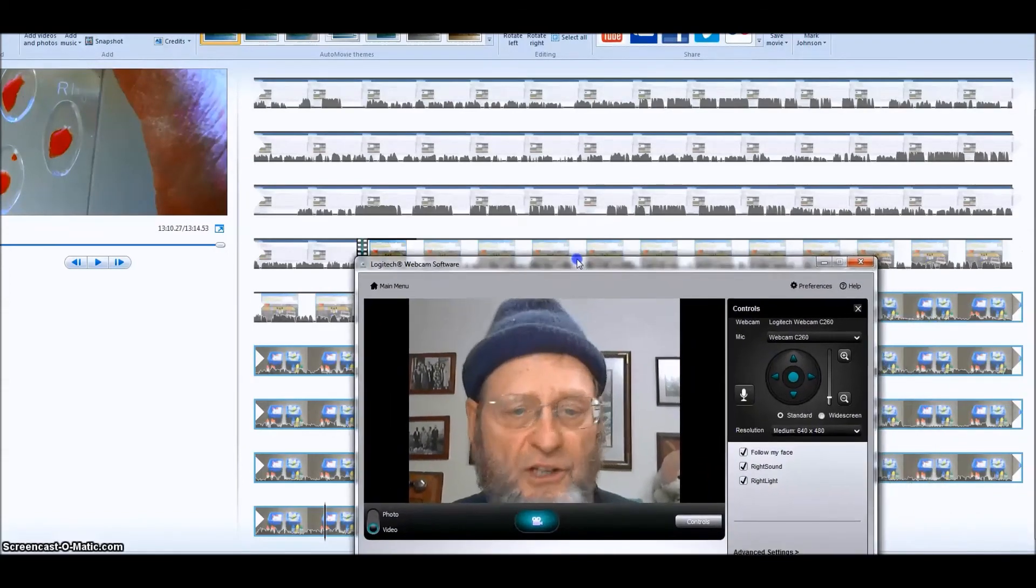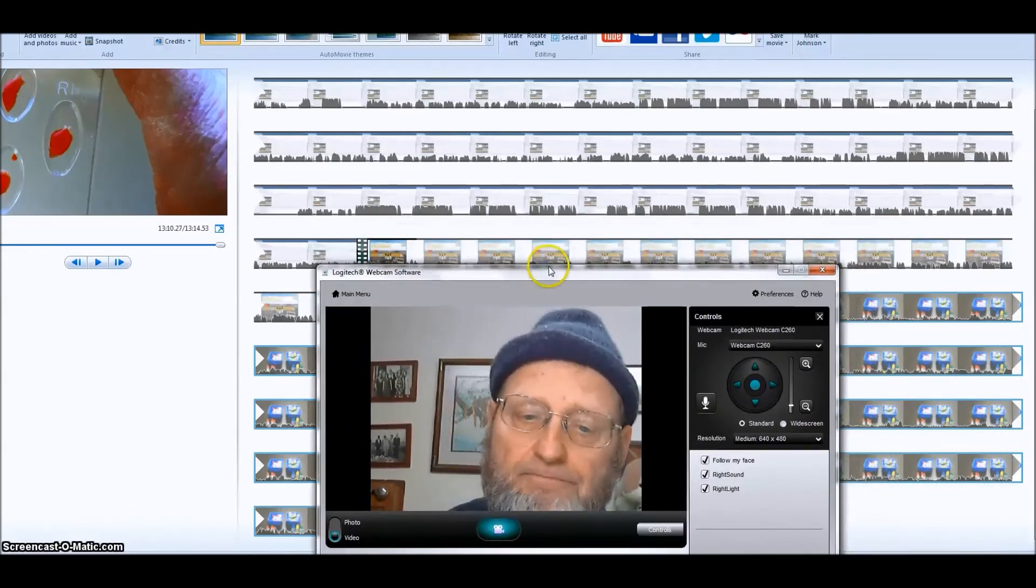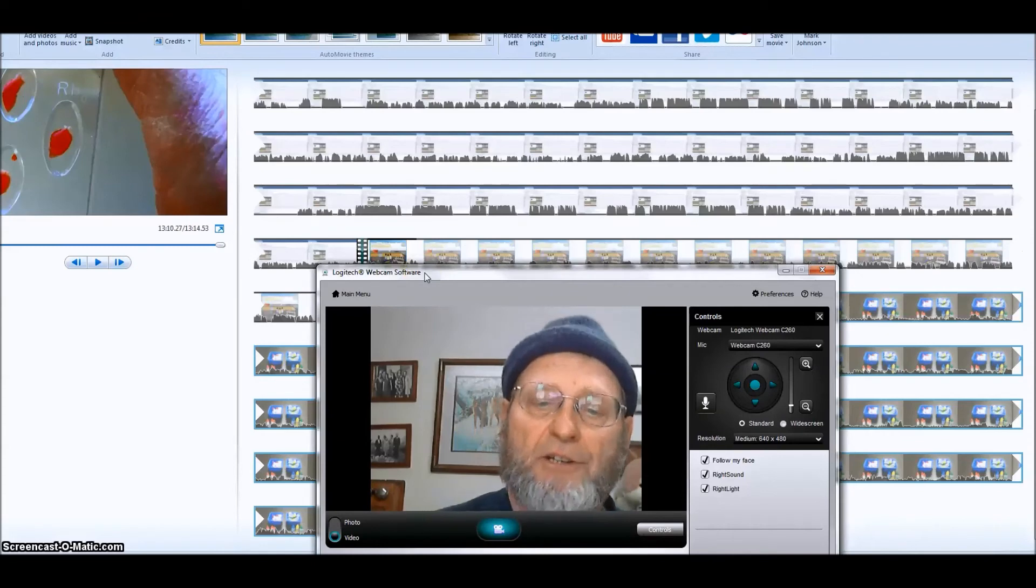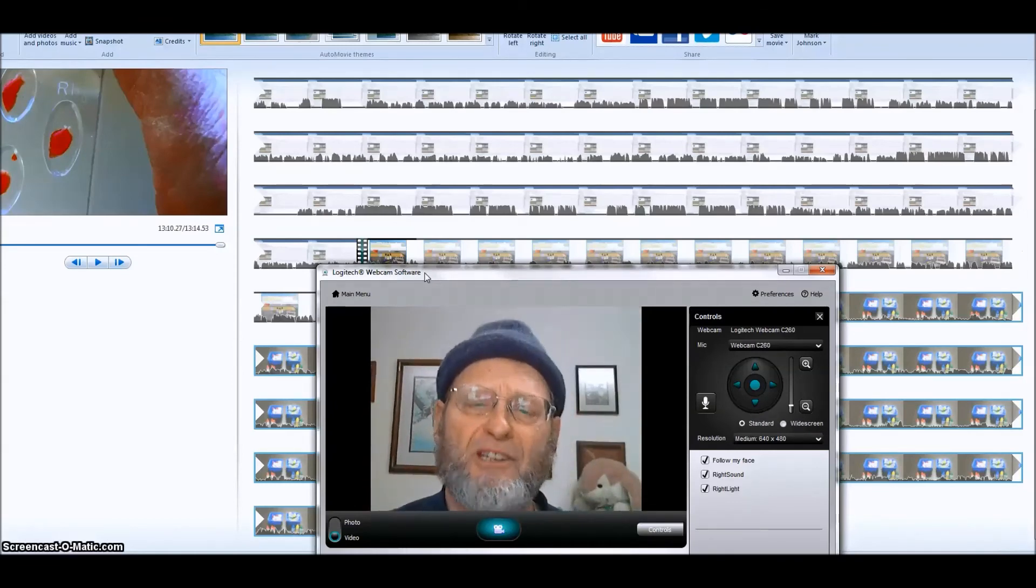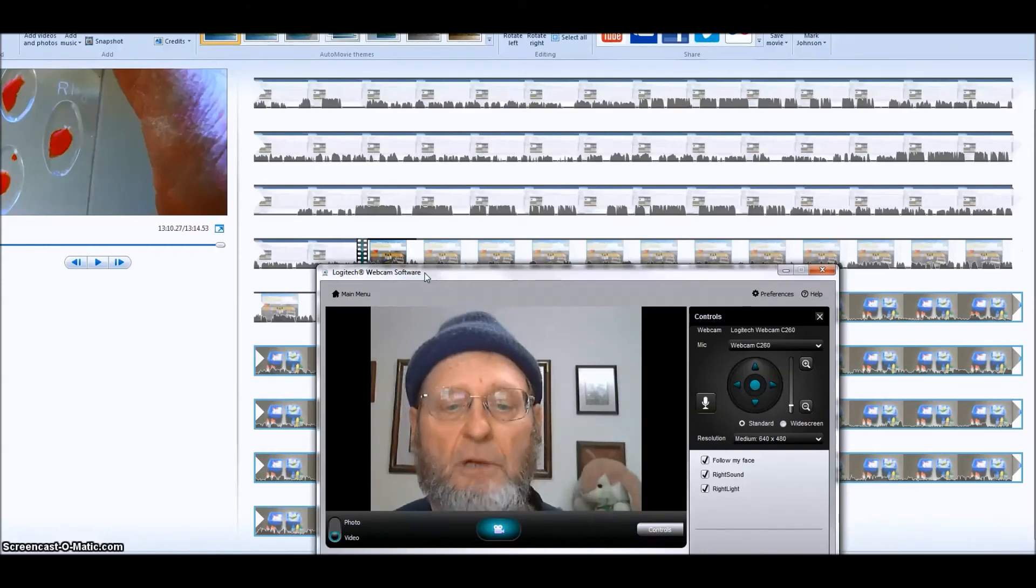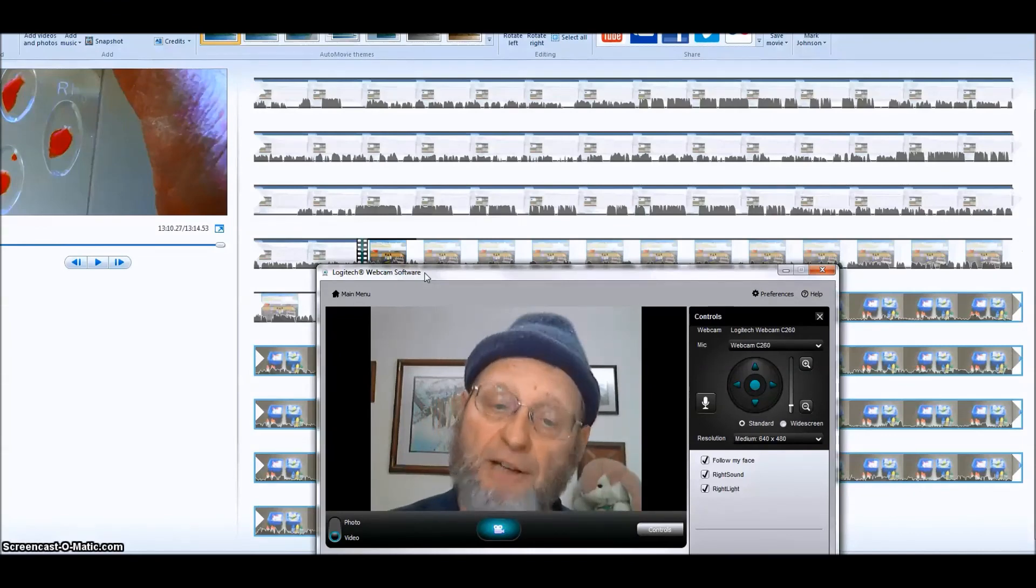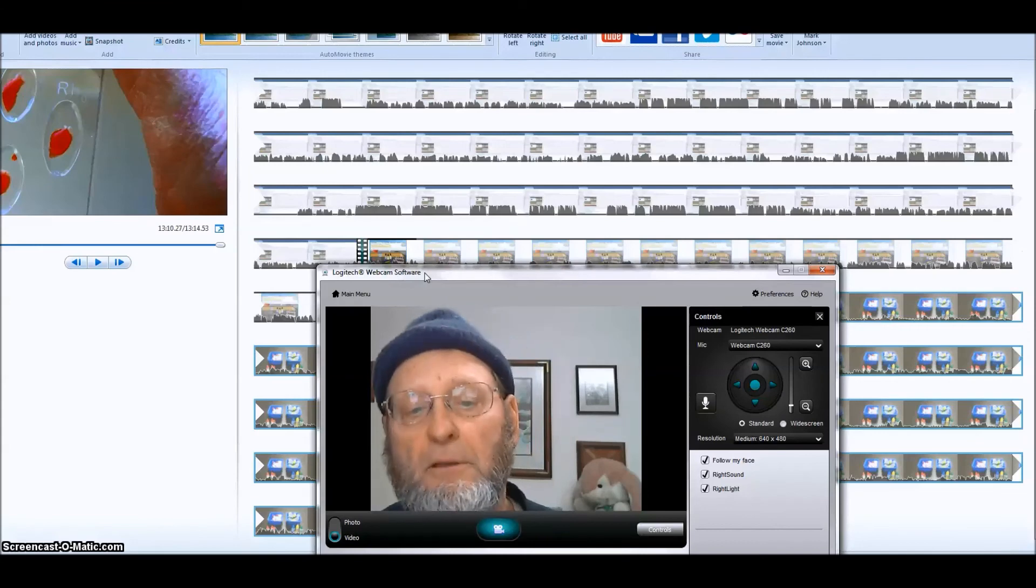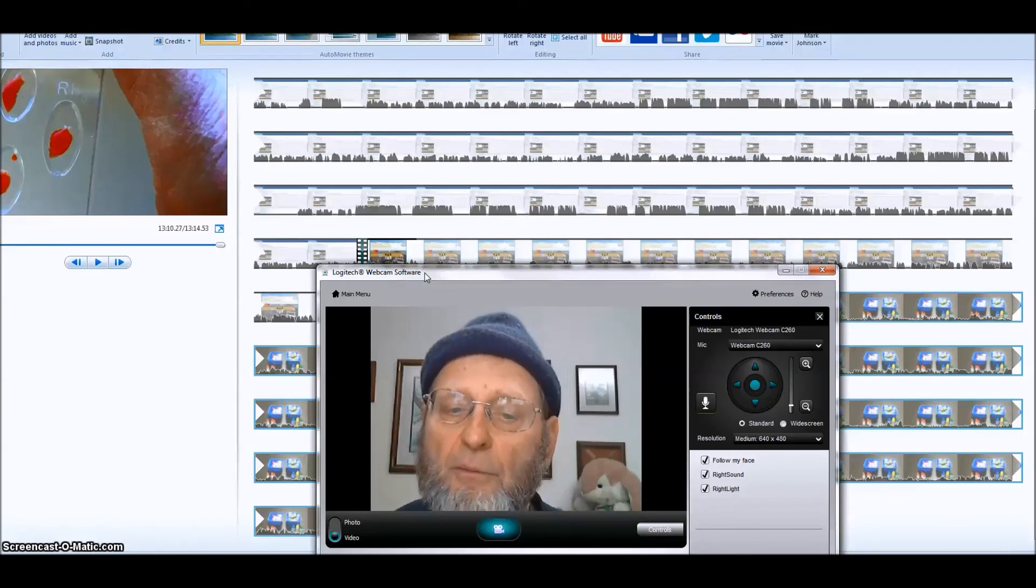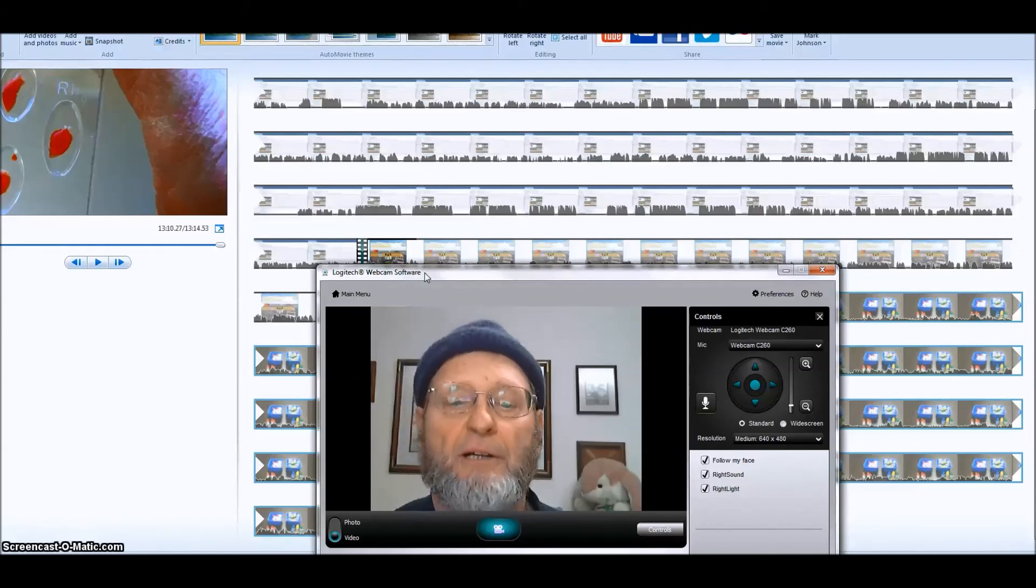And if you'll notice during this last segment of this video that I was making for you, I kept saying the wrong thing. I kept saying that the antigen was in the anti-serum and the antibody was in me. But no, it's backwards. I was backwards. And that's why I'm going over this. Because it's so easy to get confused. My blood either has the antigen or it does not have the antigen. And we're trying to find out if it has the antigen. If I'm blood type O, I do not have the antigen. Therefore, the antibody in the anti-serum bottles will not make the blood clump. But I have the antigen for RH. So, the antibody in the anti-serum bottle for RH makes my blood clump. Because it has the antigen on it. And that's how antibodies work.